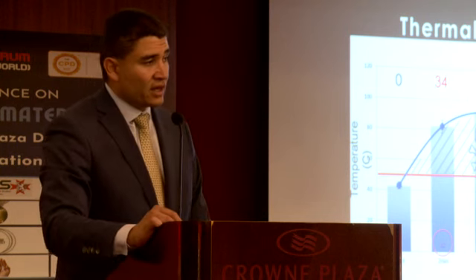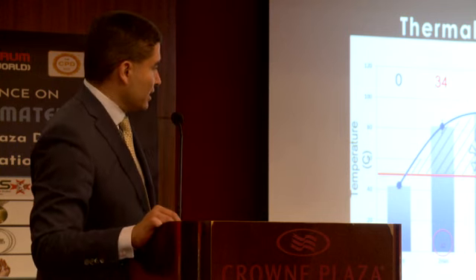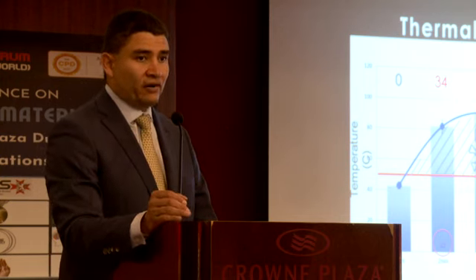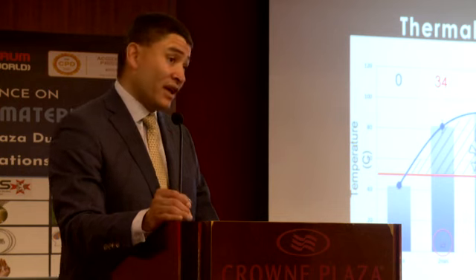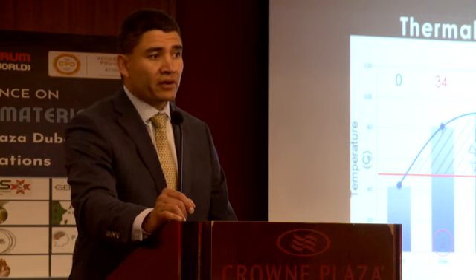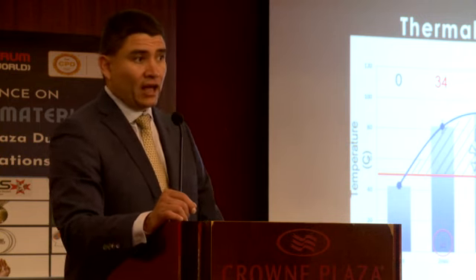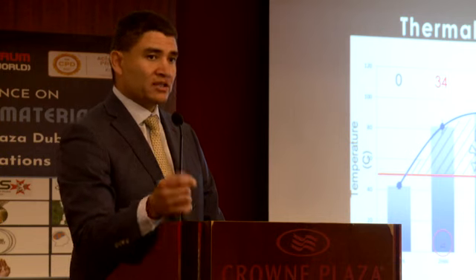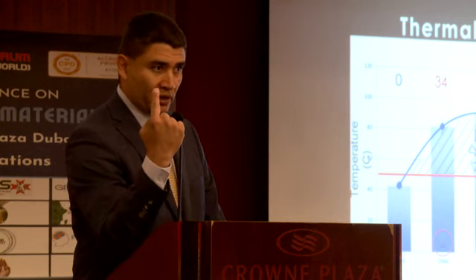So what this study told us is that all the major brands have the same problem. Guess what? 80% of the implant suppliers do not fabricate their own drills. And 80% of those implant suppliers get the drills from the same manufacturer in Germany.